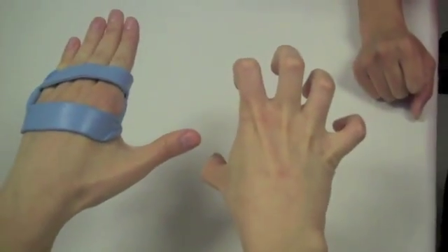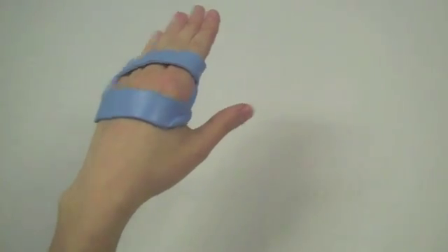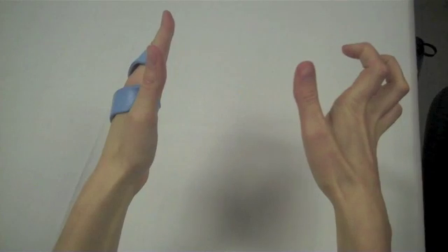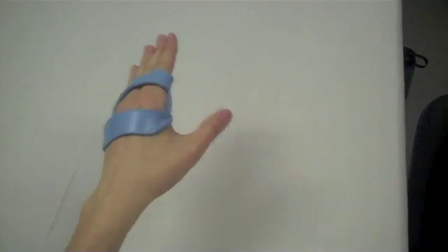Note how this splint prevents claw hand deformity. Specifically, it blocks MCP hyperextension and keeps fingers slightly flexed at the MCP joints.